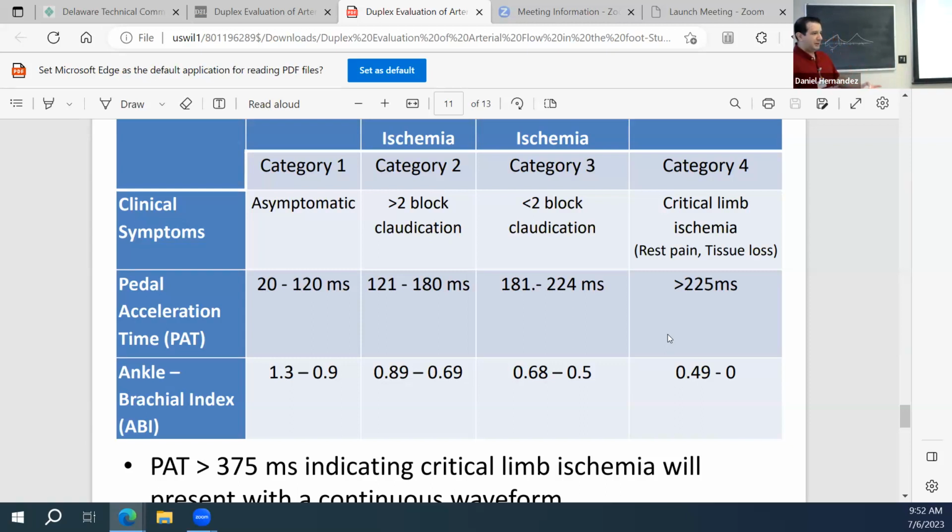You may not know what a normal acceleration time is for a particular disease segment or a limb, but they'll give you 2 numbers, one that is very small and one that is substantially larger. The larger one is the extremity or the side that has disease. They might tell you to pick between the right leg or left leg as the extremity that has the potential disease, just based on those acceleration times.